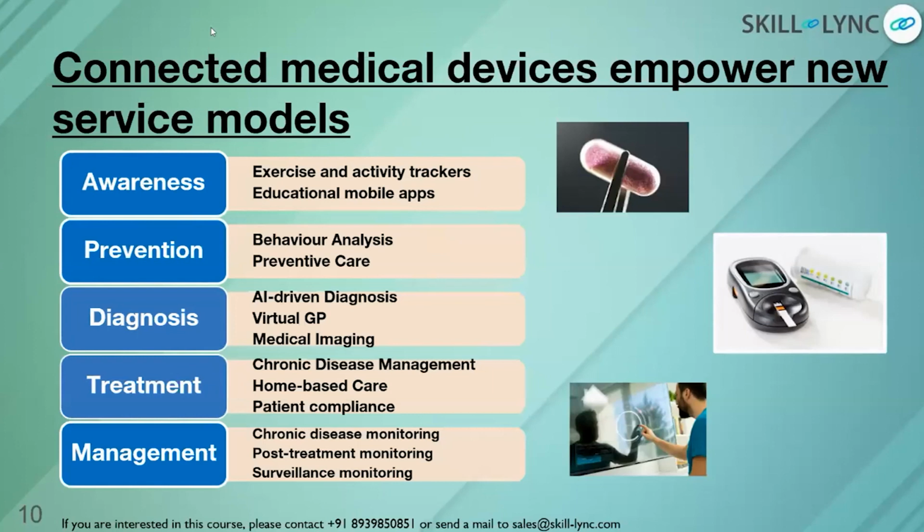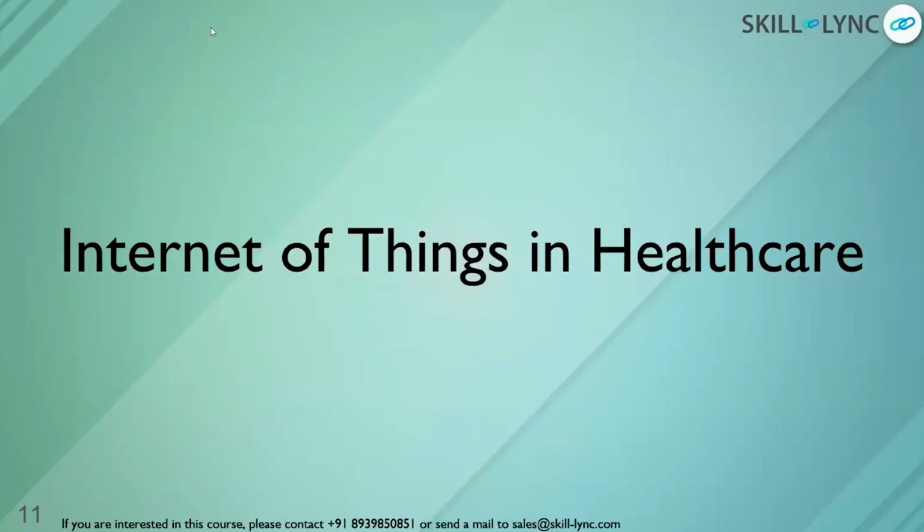If they had 50 such patients, they can see the statistics of the patients. The app can say, see, there is some variation with person C. You just see it, so that the doctor will open C's record and do a detailed study. Even that detailed study, what he is writing, you on the other end can just open and take his prescriptions as well. So this connected medical device is actually bringing up new health care models.